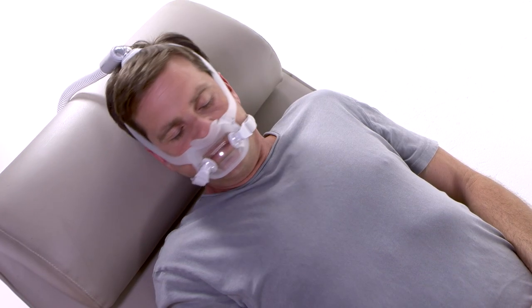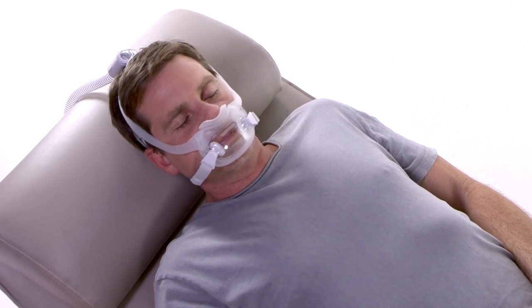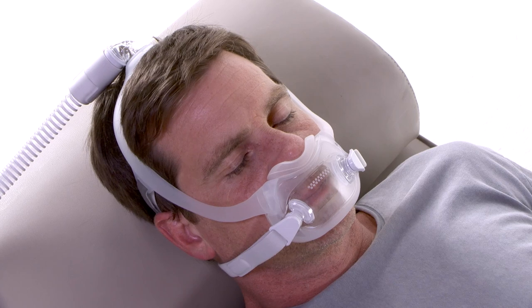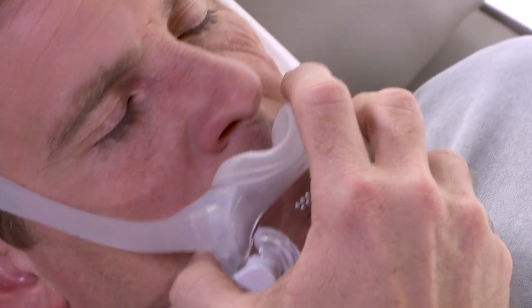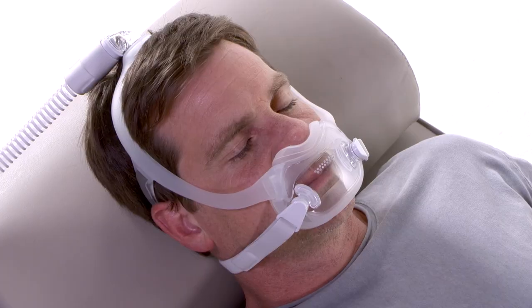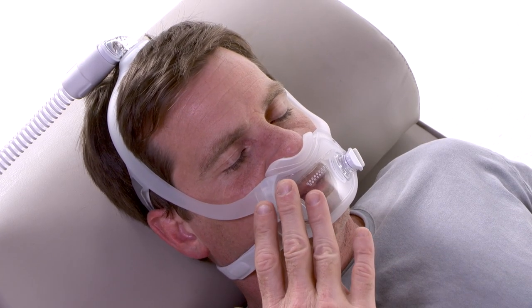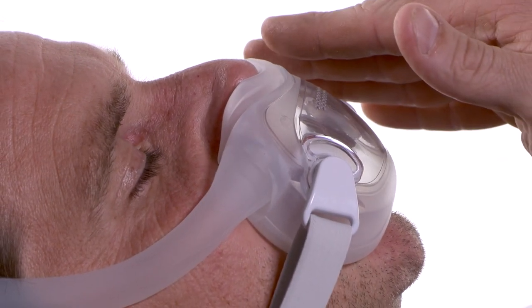It's normal to have some air leaking from your mask, but you don't want air leaking into your eyes or interfering with your ability to get a good night's rest. To correct a leak, try reseating the mask by pulling it directly away from your face and then gently setting it back into place. You should feel air escaping from the holes in the front of the mask, which must be left open to prevent re-breathing.